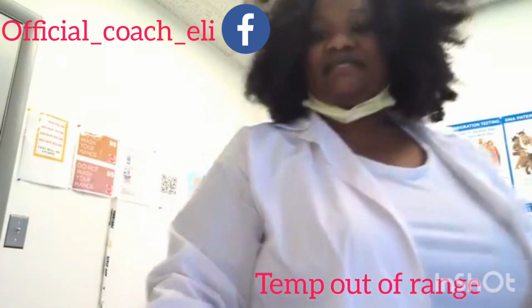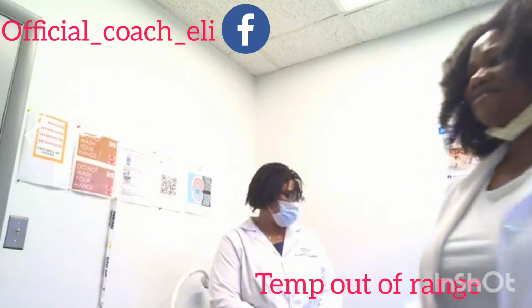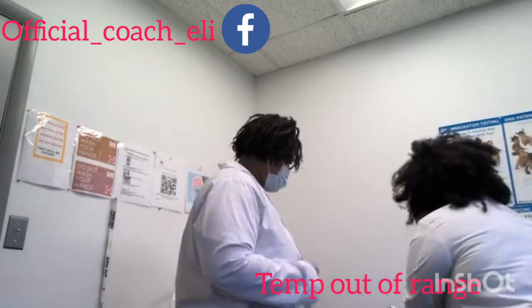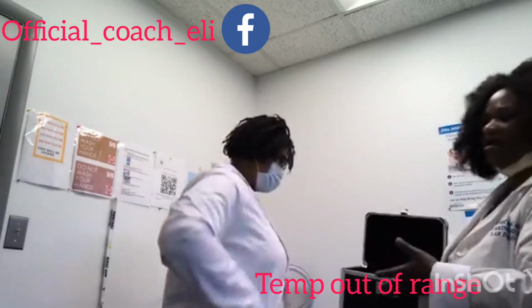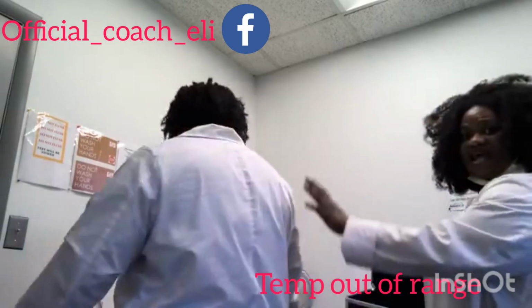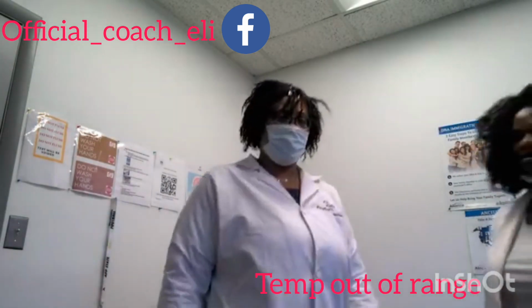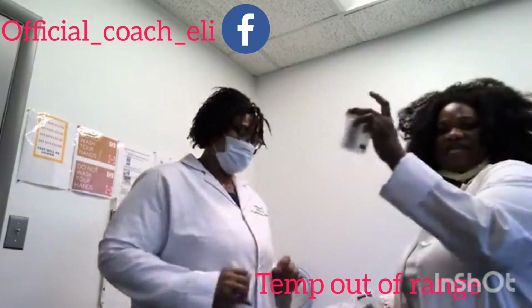All right, now that's done. I already completed step 1 of the CCF form. I'm going to ask my donor, please, Ms. Ashanti, can you take out everything and put it in this lockbox? Sure. So I'm going to open my lockbox and ask her to empty out her pockets. Thank you so much. Can you please turn around? Let me see, just to make sure that everything is out of the pockets and she is free. All right, and I'm going to ask her to select a cup, please. Can you please pick out a cup? There we go. Thank you. This is the cup that she picked out.